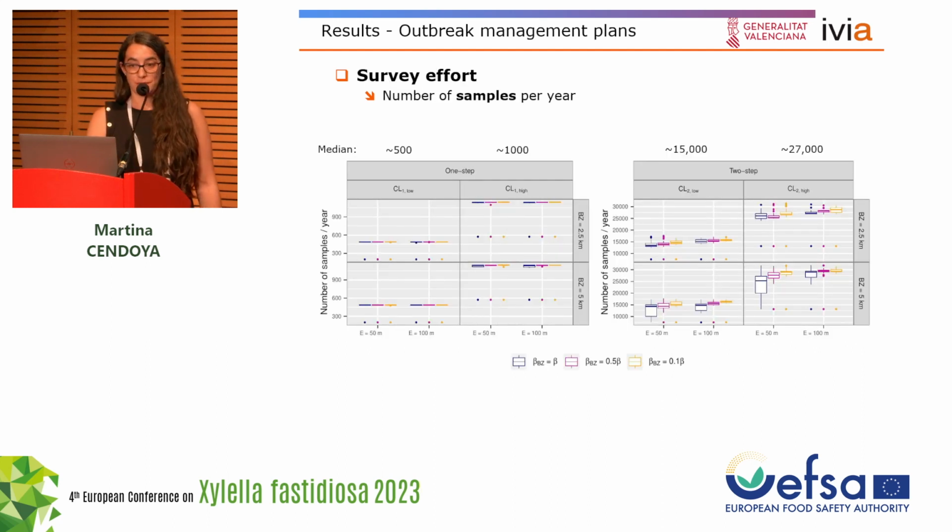However, in terms of survey effort, that is the number of samples per year, the big differences are between the 1-step and the 2-step approaches.